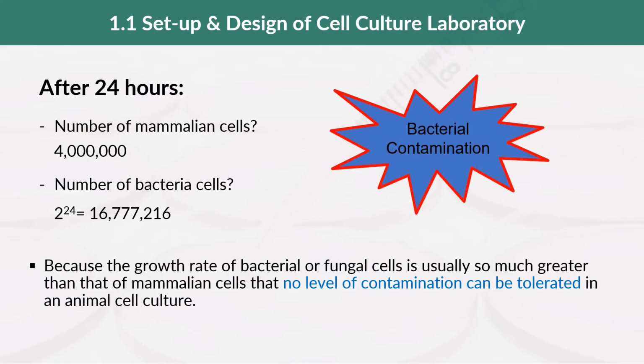What does that mean? You have a bacterial contamination in your cell culture flask, because the growth rate of bacterial or fungal cells is usually so much greater than that of mammalian cells that no level of contamination can be tolerated in an animal cell culture.